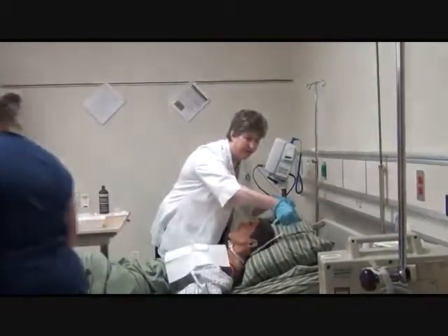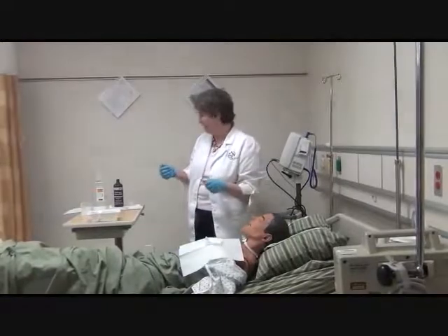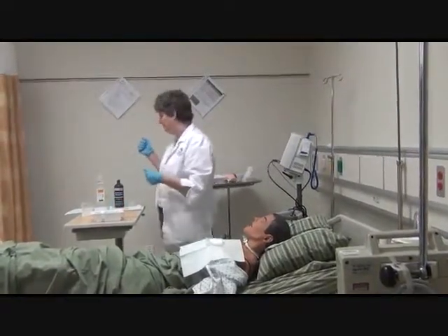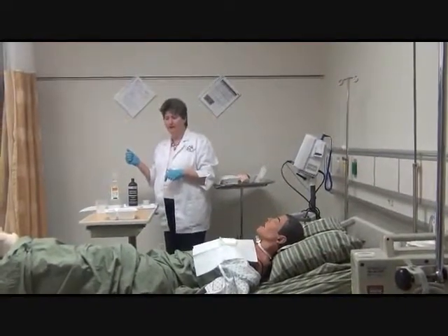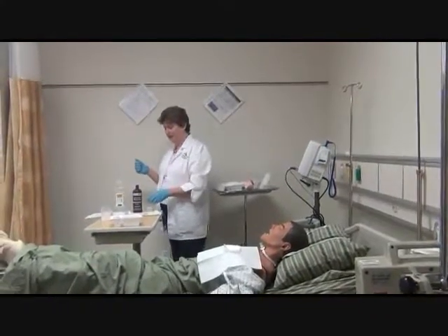And then I'm going to put those ties up, again, so I don't ever get them confused with the gown tie. I'm now going to pour my solutions, and my preference is that I do my hydrogen peroxide the furthest away from me so that I don't ever accidentally use it and let it get in the patient's airway.